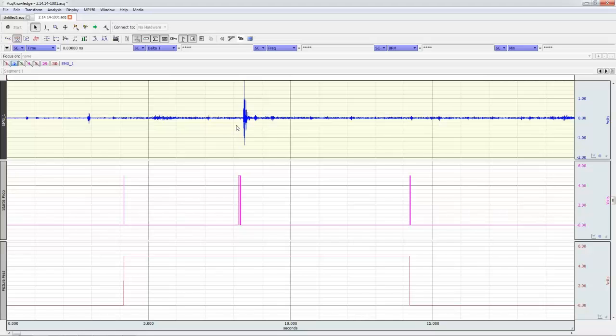Okay, to rectify just means that we're going to split this in half at the 0 mark, and we're going to add anything below the line to everything on top of the line, which will give us a data signal that can be quantified. Now, smoothing is basically taking all those jagged edges, these sharp movements, and averaging them over a period of time to produce a more consistent signal, again, for easier analysis.